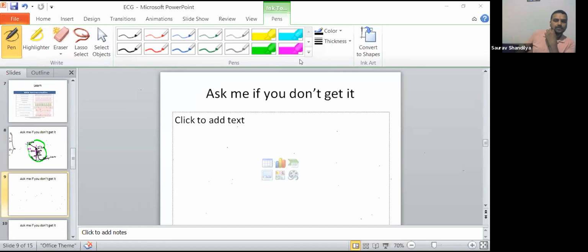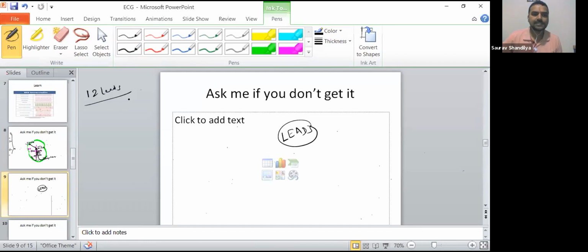Yeah. So now the next part is to talk more about leads of ECG. I'm telling you there are 12 leads. Let me write here so that you can see. 12 leads. Very easy to remember.